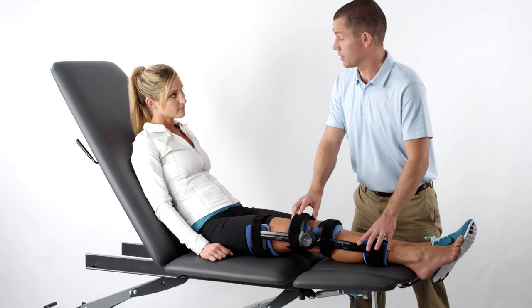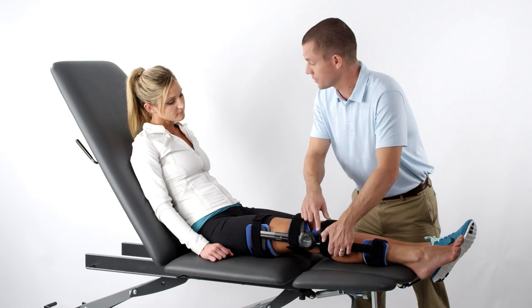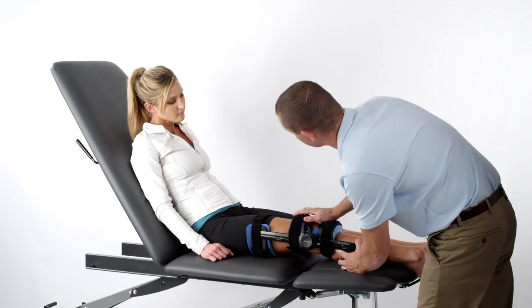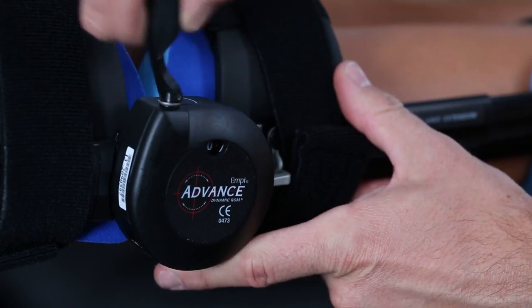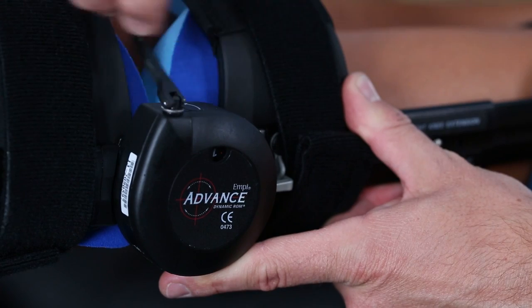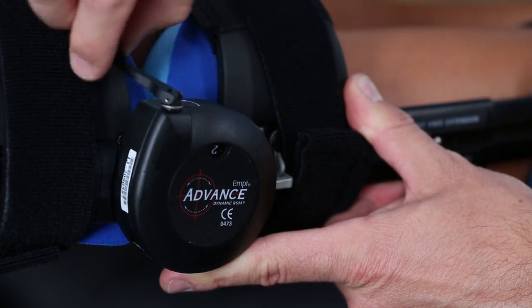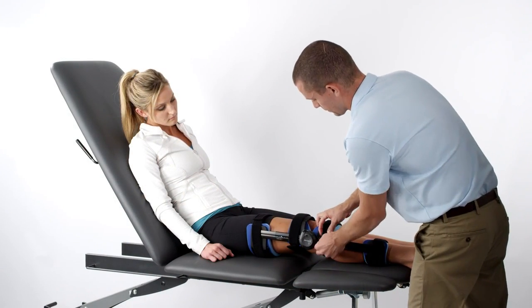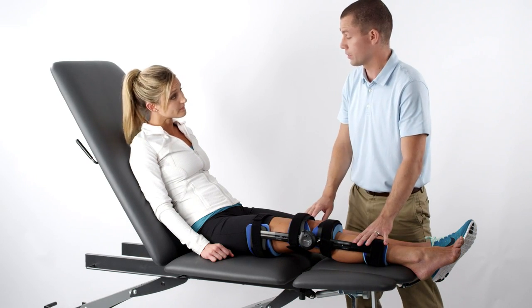When you adjust the tension, make sure that the lock lever and safety are in the locked position. Then check the tension indicator window to verify that it's set at the correct current tension level. The numbers that appear in the indicator window start at 0 and increase to 10, with each number representing an increased level of torque. At the initial fitting, set the tension level at a very mild pressure that is comfortable for the patient, and instruct the patient to wear the orthosis for 1 to 2 hours.